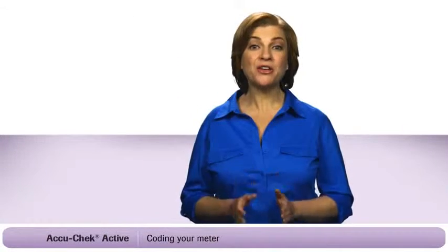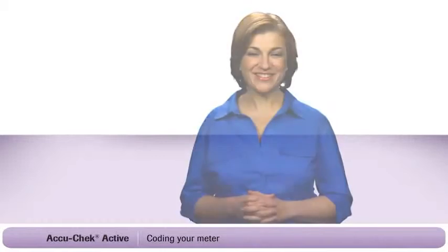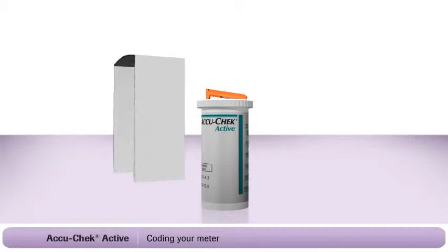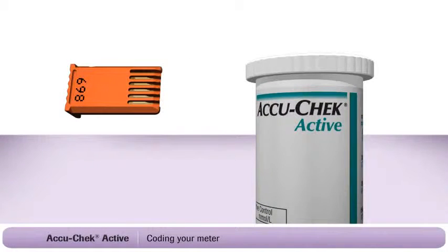Let's start by coding the meter. Coding tells your meter how to read the test strips in the container you're about to use. Take the box of strips and open it carefully. Inside, you'll see some paper with technical information, a container of test strips, and a small chip. This is the code key.